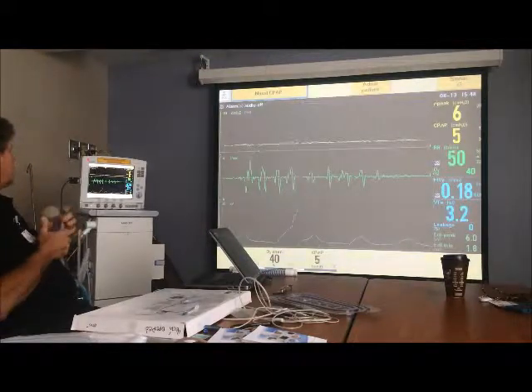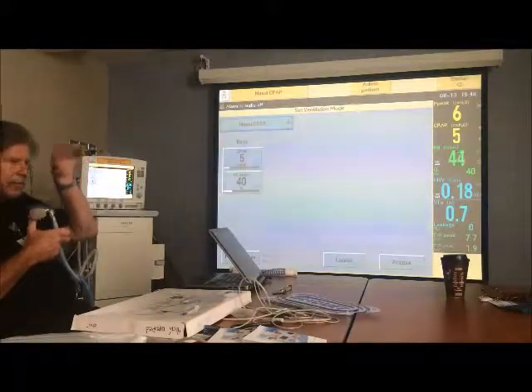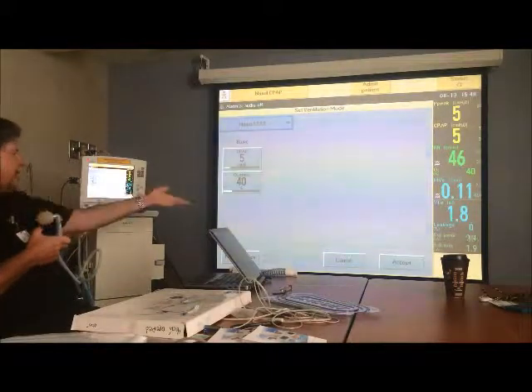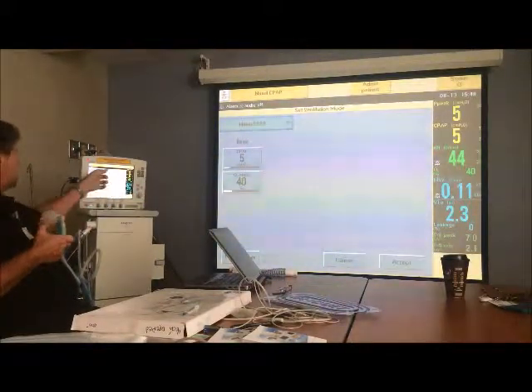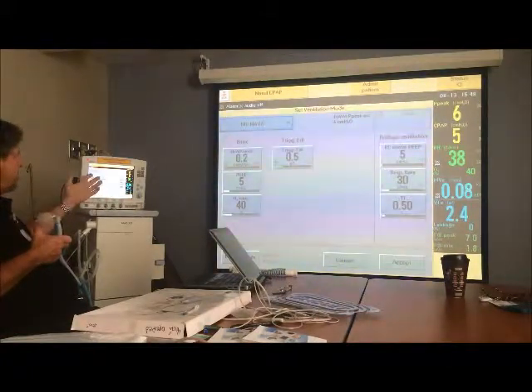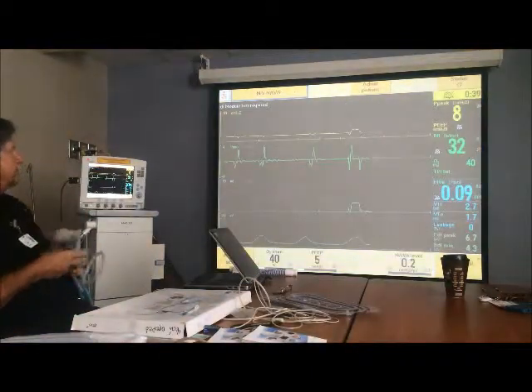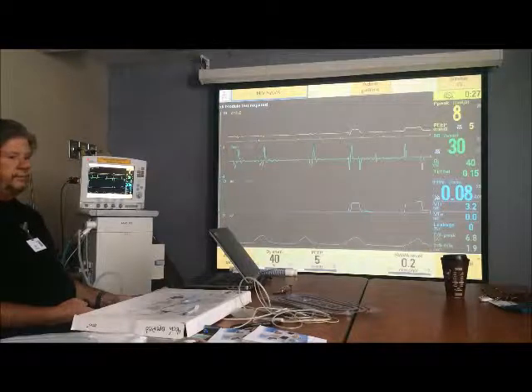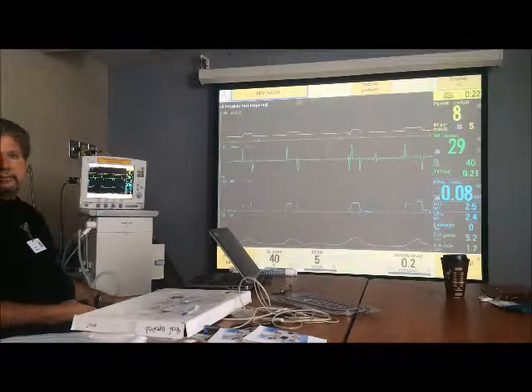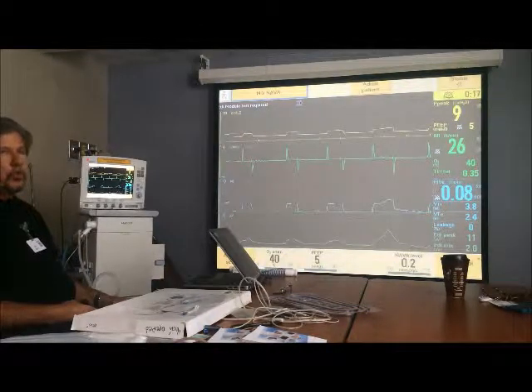so what do you do? You go here, you don't have to go to that NAVA preview screen to set the top of the white line at the same level because you're not going to be providing any. You see that he's got a relatively normal EDI, so just go here, go to non-invasive NAVA, set your NAVA level at 0.2, his PEEP at 5, and his trigger, set the backup where you want, and just touch accept, and now he's in NAVA. But he's got that backup. Okay, so that's the long and the short of it.